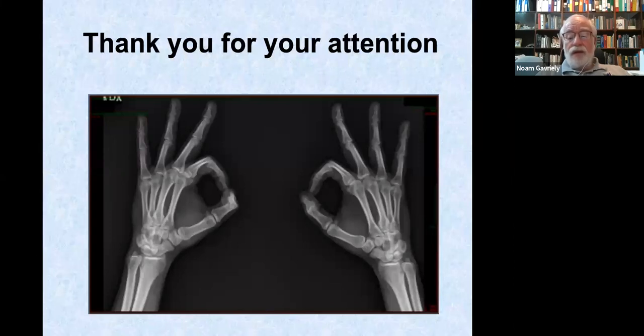That was a discovery that we made just a few years ago with the help of a French anesthesiologist, Dr. Estebe, who really didn't know that he was helping us, but he was brave enough to have an MRI with the pneumatic tourniquet on his arm, and that taught us so much about what happens beneath the tourniquet. And after we saw those images, we realized that HemaClear has to be put away from the muscle.